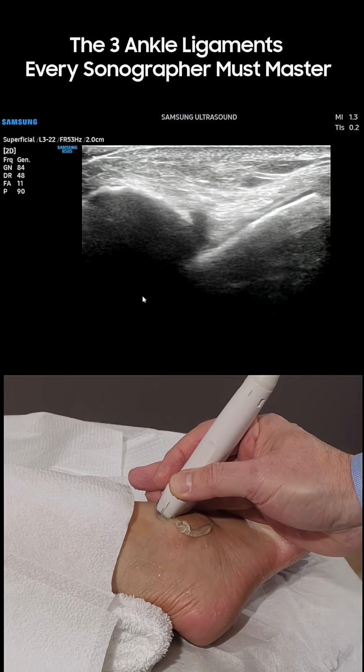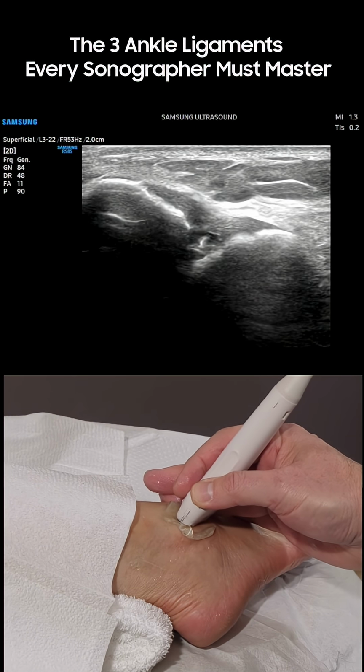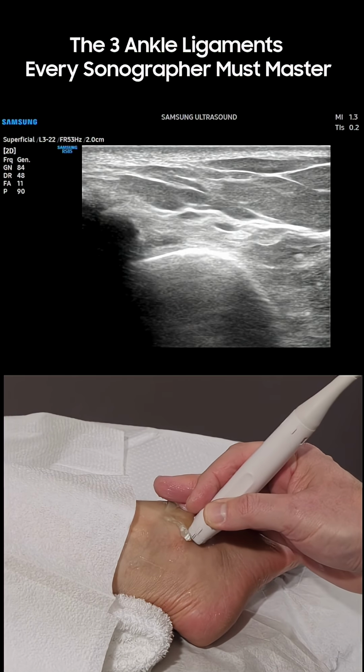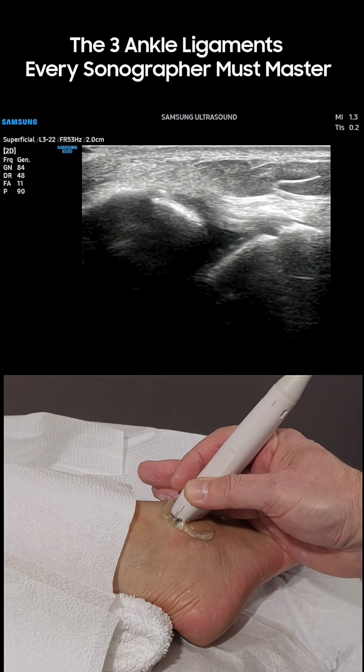So if you don't see the ligament, keep moving the transducer more distally, like this. And even when you come off the fibula like that, then just back up a little bit. That is where you're going to see the anterior talofibular ligament.